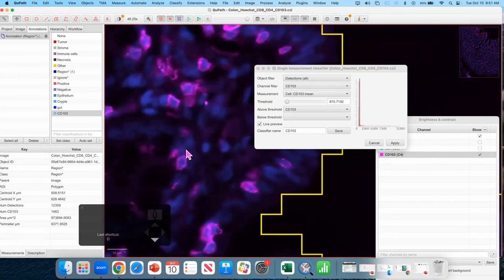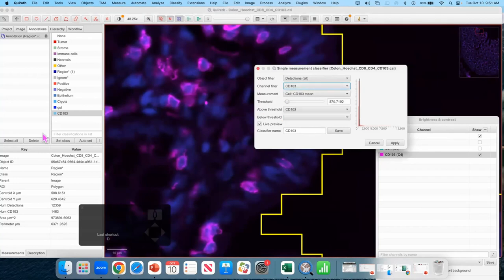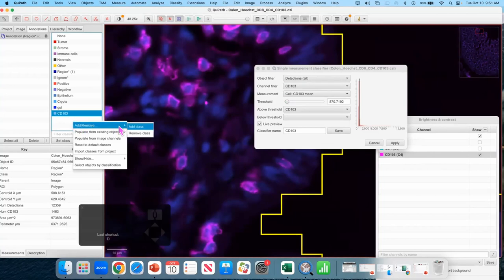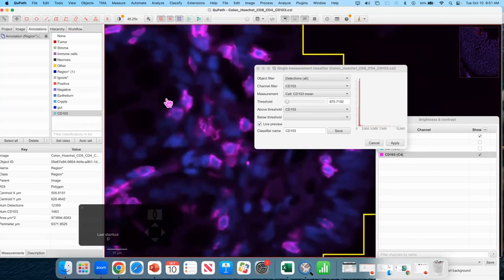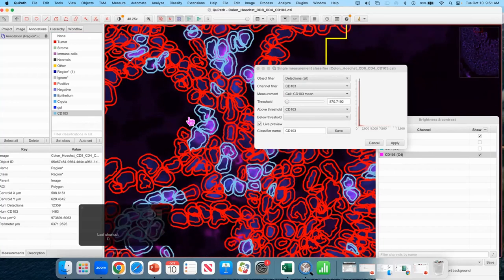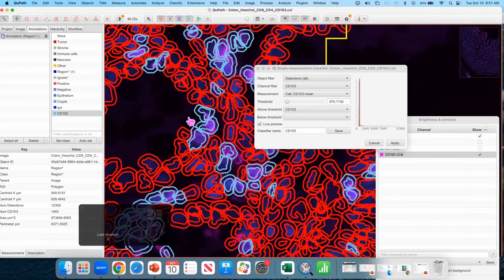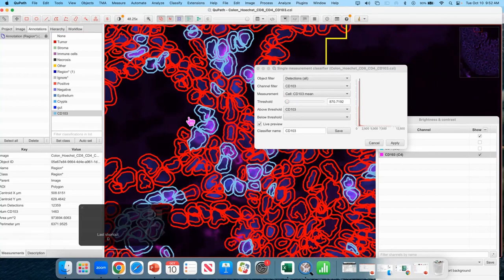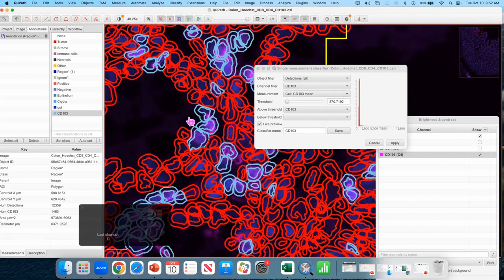So go through your tissue. How do you get CD103 as green to appear on the above threshold? Yep you first make the class. Right click, add, add class. Okay so super important that you don't just look at one area because things happen and little bits of your tissue will be brighter or dimmer than the rest. So you want to look at all the corners of your tissue. If you have that ideally you want to actually look at multiple samples. So like pick a threshold that looks good on this sample then go check your knockout or go check your isotype or whatever controls you have whatever groups you have and just make sure you're satisfied with your threshold across the board.